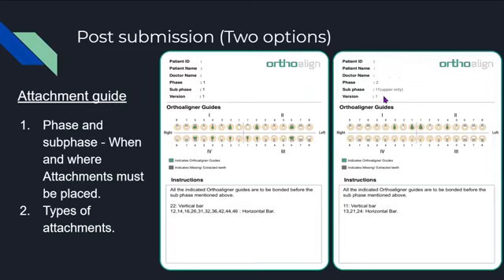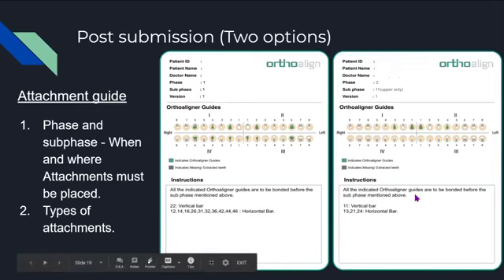Once the patient is at the end of stage 10 of the aligners, he will then have to put the attachments on the patient's upper teeth over here, and we can see exactly what is being indicated, and again the type of bars being used.